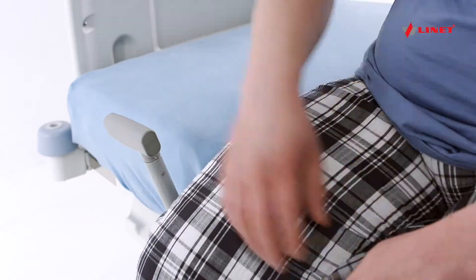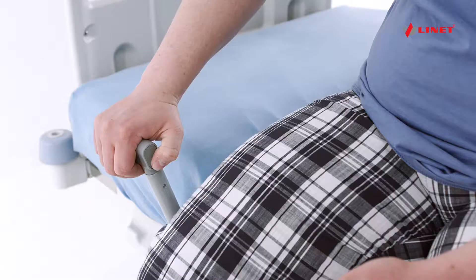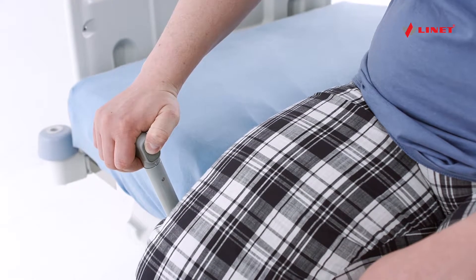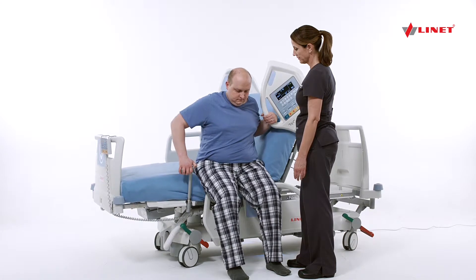Once the patient is ready to stand, utilize the built-in sit-to-stand device, the mobile lift, to allow for active participation by the patient. Raise and properly secure the mobile lift handle located on either side of the bed.